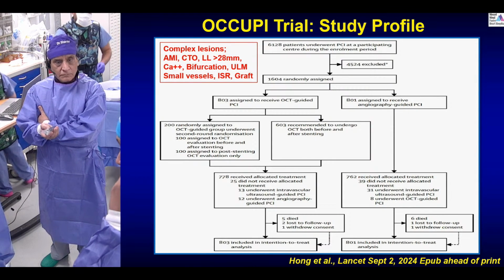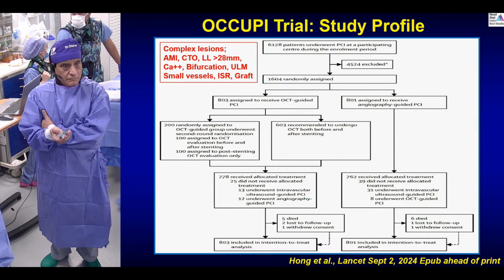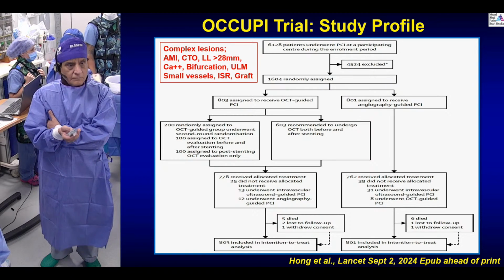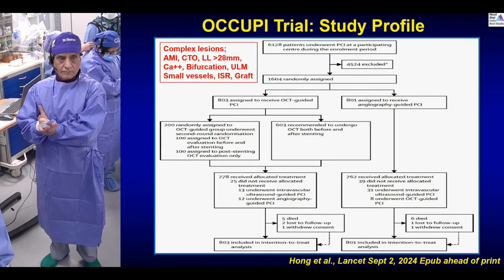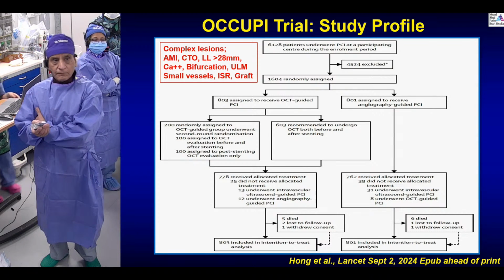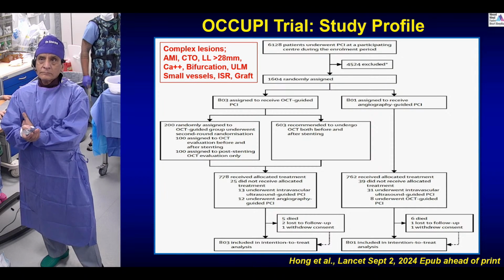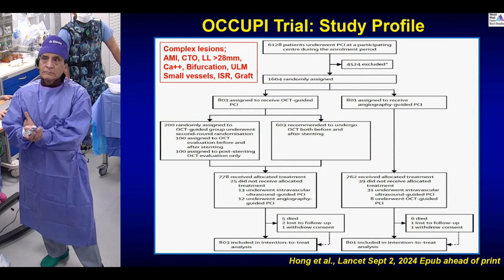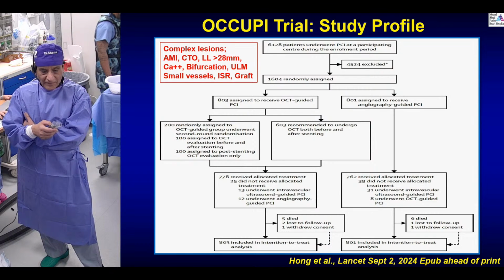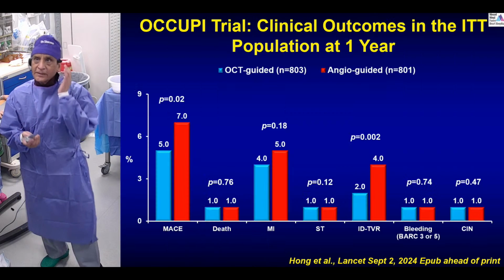We do that. Even here, if you pay attention in the early part, there was not a lot of dye. There was dye stasis when I did my first OCT. I would be very careful in doing small vessels, and large vessels you don't see anyway because you need more dye. I know this is the criteria. They said 2.5, they could do it. Myself and KISKI, we were discussing how we can do OCT in a 2.5 vessel with disease. Yeah. So I would say less than 2.5 or more than 4.5 are not good cases for OCT. But they did it in the trial, but that's okay.